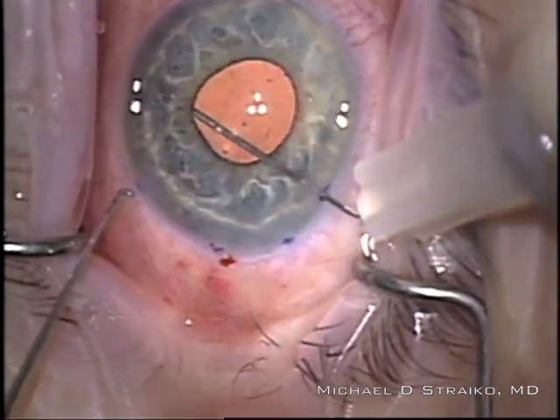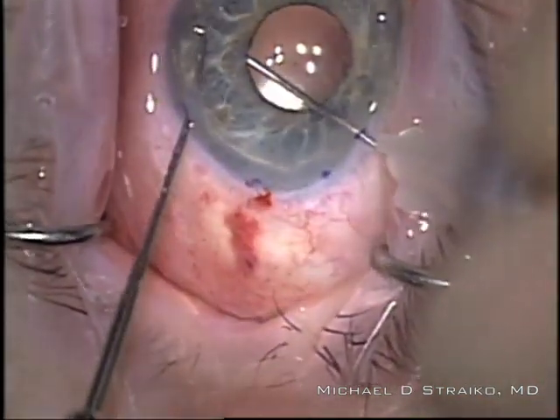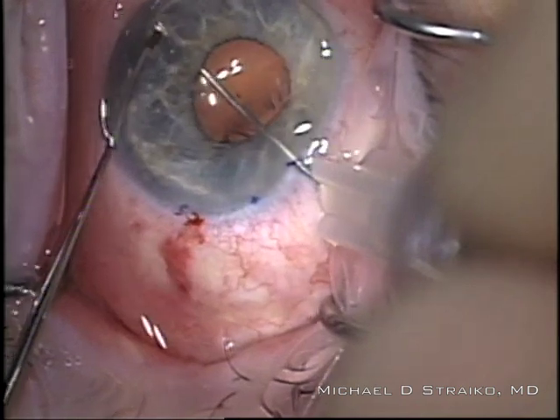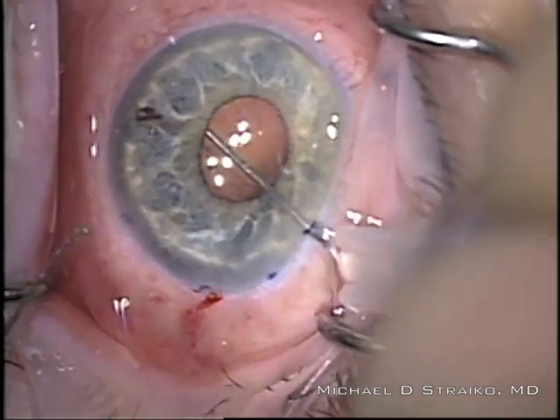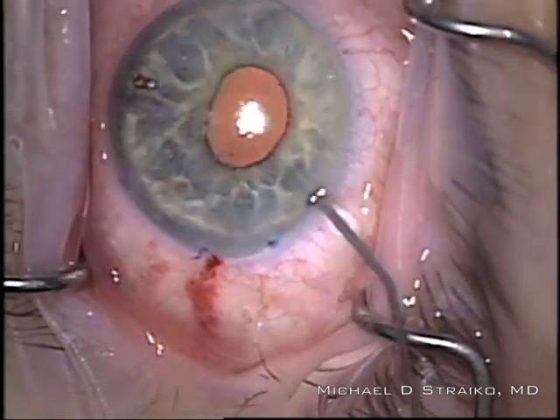I'm going to make a small peripheral iridectomy with this needle, and I'm going to scratch down on top of it with a Sinski hook, then pull to enlarge it. And these, amazingly, are quite slit-like post-operatively, but they get the job done for the first week of preventing pupillary block while there's air or gas in the eye.